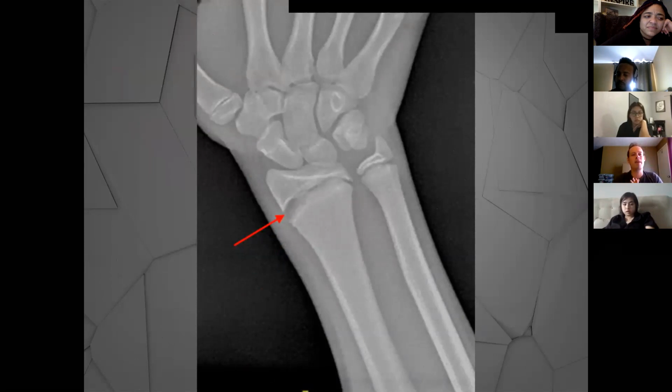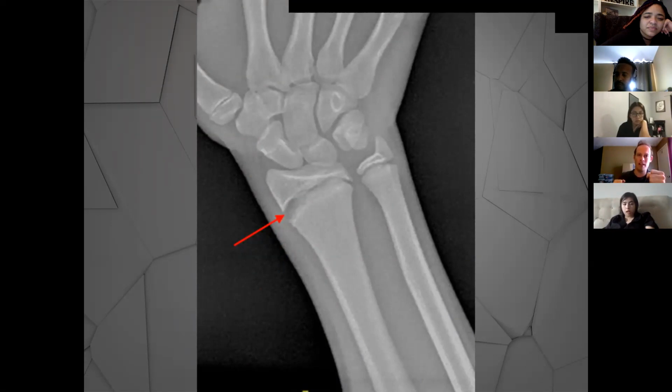The last thing I want you to do is be in clinic, see a wrist pop up like this and you're like, whoa, let's say your tech is Mr. Smith. Mr. Smith, look at the fracture on that radius. He's going to look at you like, did you just call that a fracture? That is not a fracture. That is a growth plate on that child's wrist. That is the epiphyseal plate, or the growth plate. But you can see how it'd be easy to think that was a fracture if you didn't know what you were looking at.